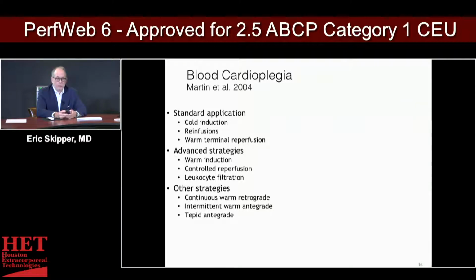Advanced strategies can include warm induction, controlled reperfusion, and leukocyte filtration. Other strategies can look at continuous warm retrograde, intermittent warm antegrade, tepid antegrade. So you can see there are any number of variables literally looking at temperature alone.